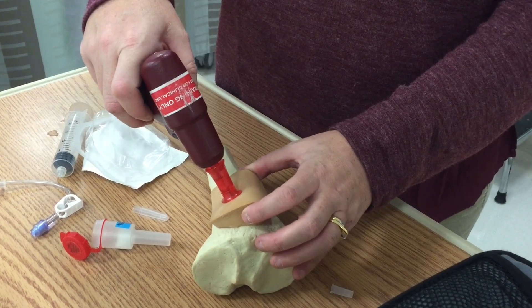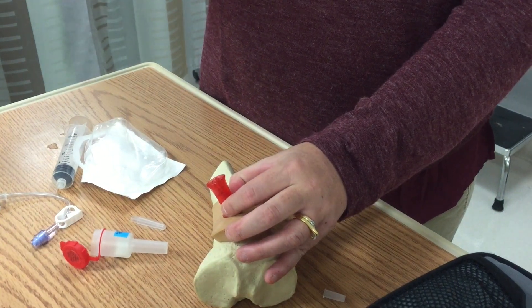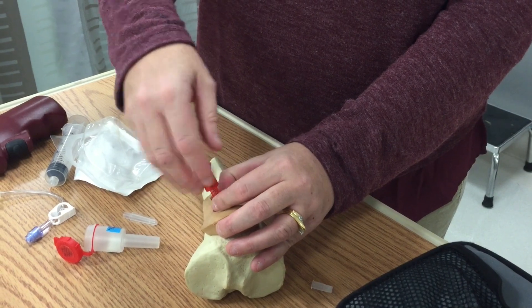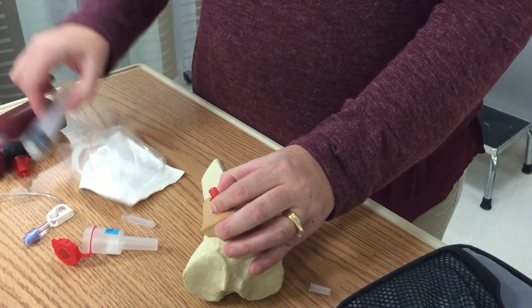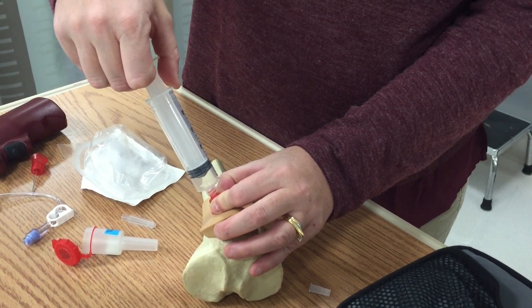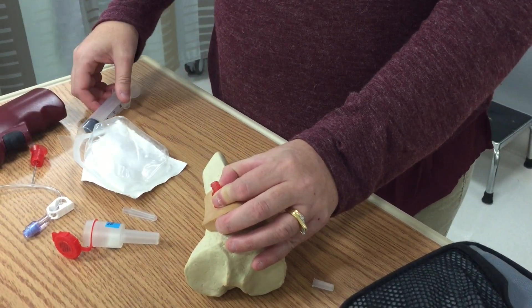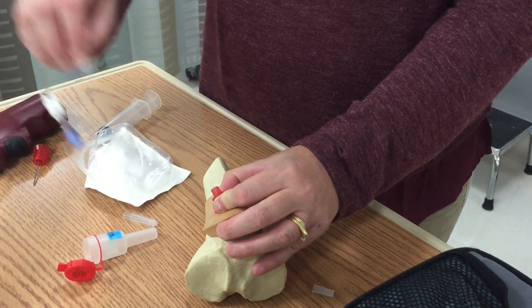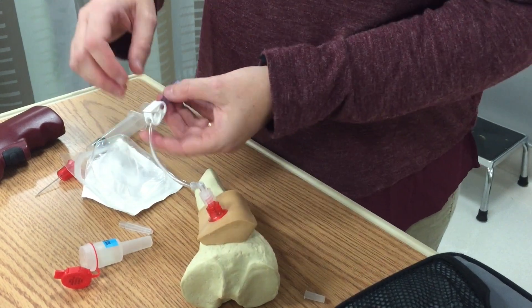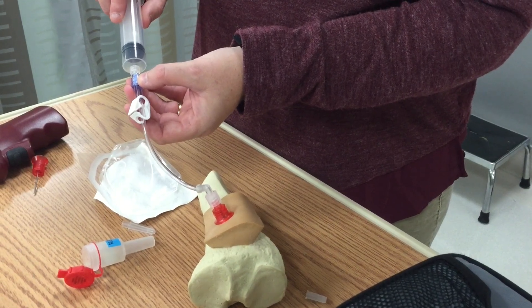At the point that your IO needle is secure, you will remove your drill and unscrew the top cap. You may attach a syringe to the top and aspirate as a way to check that you're in the bone marrow and that your needle is properly placed. You may also attach this to an IV setup, which is included in the kit, and then you may use this to run fluids, to draw blood, to draw bone marrow, or to give medications.